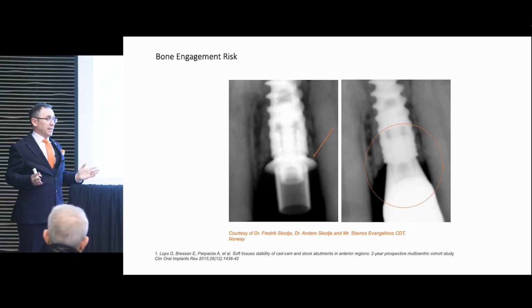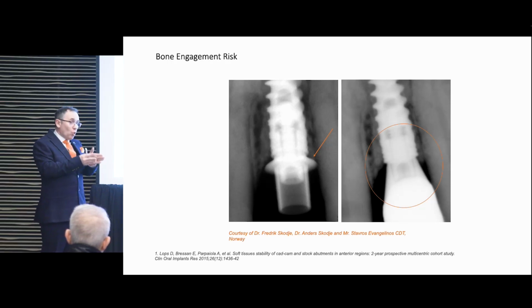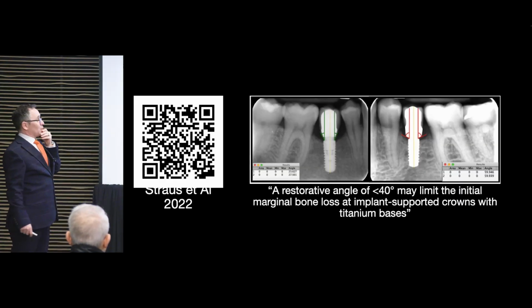More and more implants that we see in our lab are all going deep subcrestal. So we're seeing more and more of that, and we're having to be very wary not to risk impinging on the bone. Martin, this is yours because it's science.